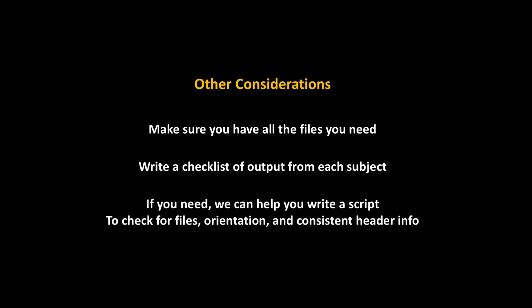Now, if you need, either me, Mike, Bennett, we all have the skills to write you scripts to check for files, to check for things like headers, the orientation, all that information about TRs, voxel size, make sure that's all consistent. And if it is, usually that makes the rest of your pre-processing a lot smoother. So again, this isn't something that you see in your data per se, but it's every bit as important.